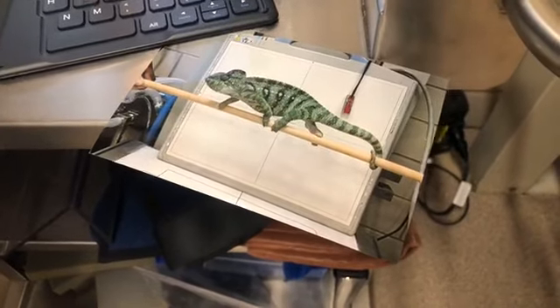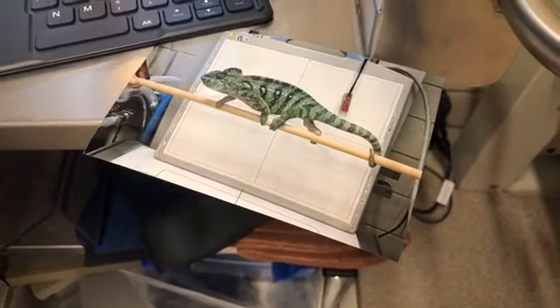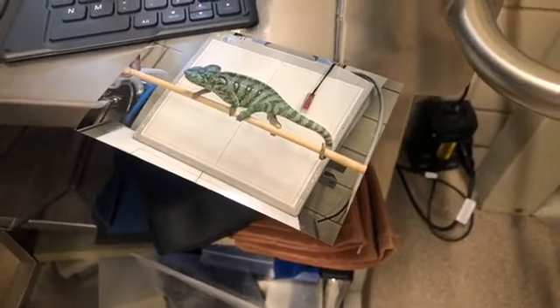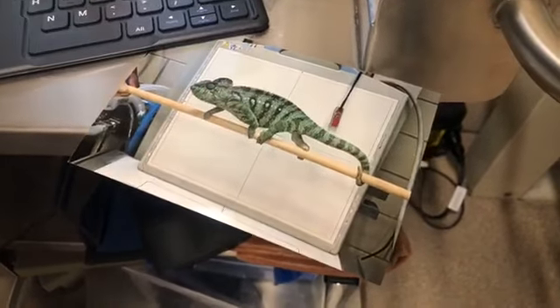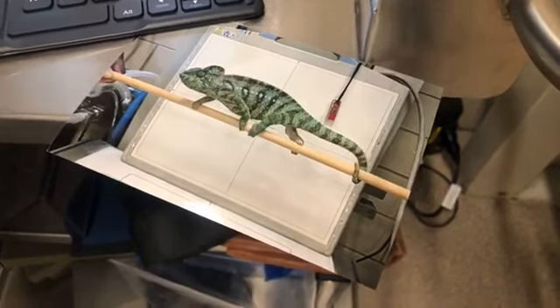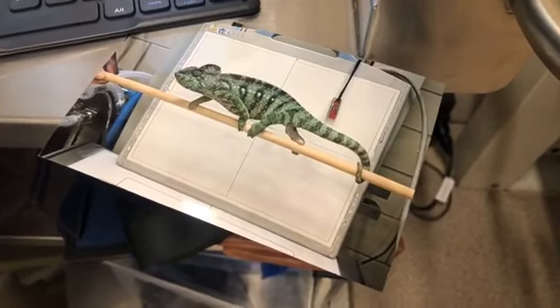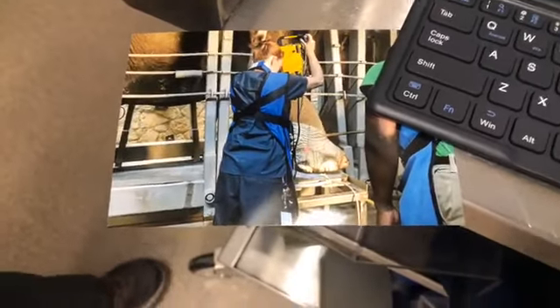So cat and dog, a lot of times you'll hold the animal down on the table, and we will too. Birds, we can do them awake, we hold them down on the plate, we take their picture, and then we're done. Or if we anesthetize them, but sometimes less restraint is better. So this chameleon, for example, I just put him on the end of a stick, which is very natural for him, and he wants to just grab on a thing, and he just stood still and got his picture taken. It was awesome.